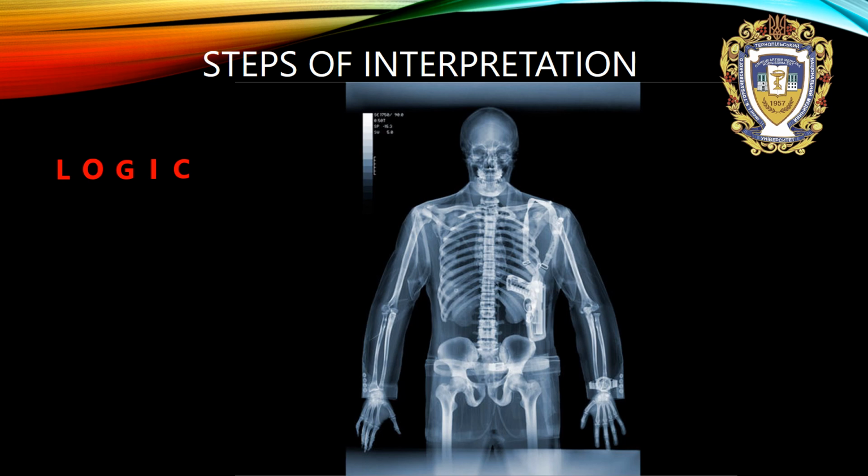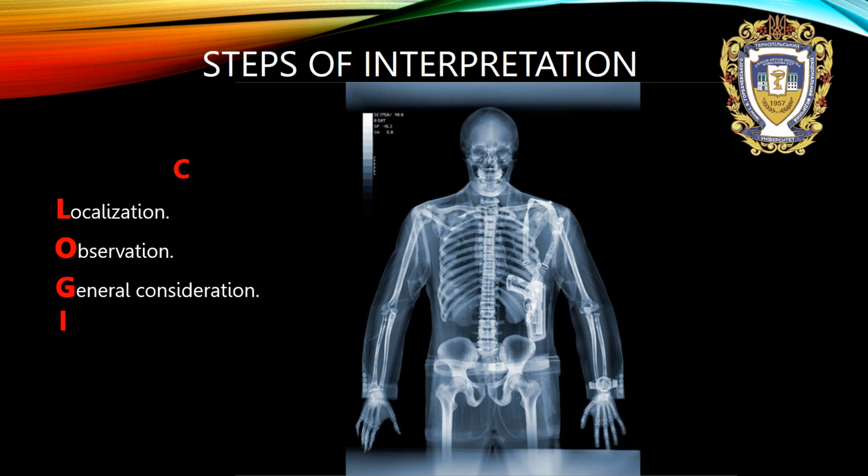And for interpretation, I would advise you to remember this abbreviation: LOGIC. What does it mean? L, Localization. O, Observation. G, General consideration. I, Interpretation. C, Correlation.